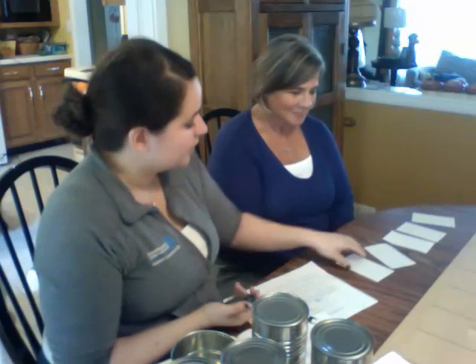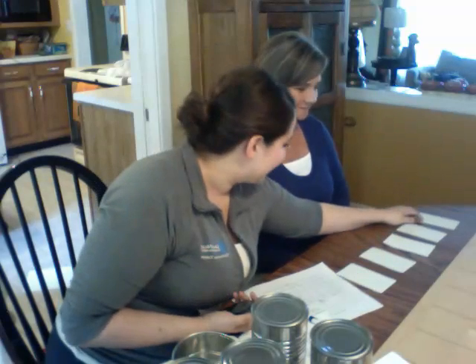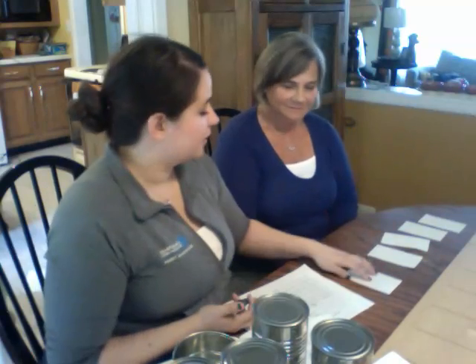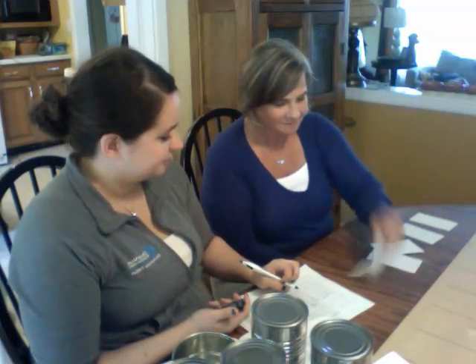Very good. All right, now we're going to do the same thing with your dominant hand. I guess we can probably just leave those, huh? We'll set them up straight. You want to help me, I understand that. All right, so put your right hand on the table, and ready? Go. All right, that was my fault. We're going to have to go ahead and start with the right side. I'm sorry, I didn't explain that well enough, but that was really good practice with your right hand. Okay. So go ahead and place your right hand on the table, and go ahead and start. Very good.